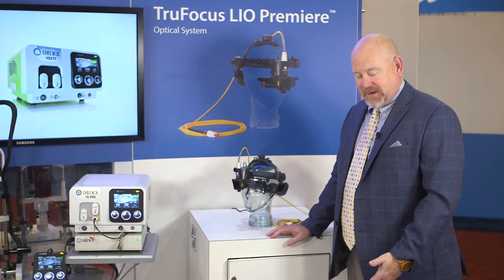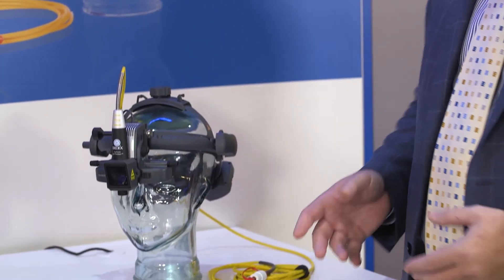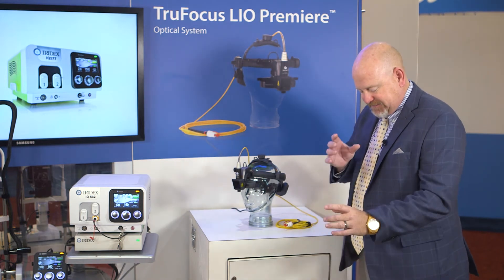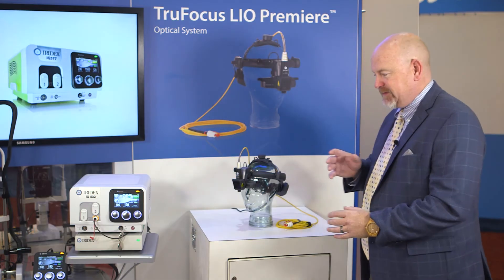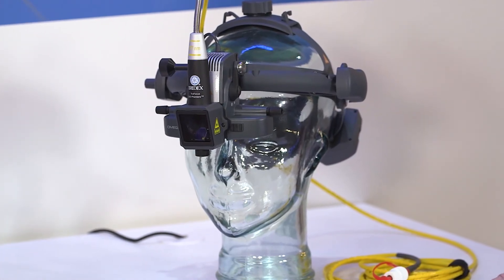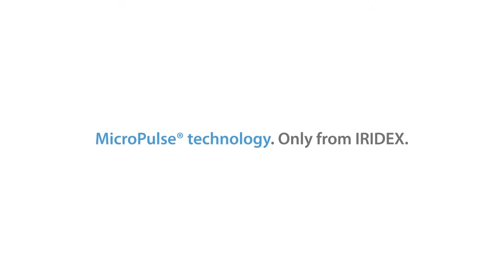Another advantage of the wireless footswitch is the ability for the physician to not be tethered to the laser when using the LIO. With the LIO on the head and the patient in a supine position, as he's focused on the patient, he can also adjust the power without leaving the patient, going back to the laser, and coming back to the patient. He can be all set up in his lane or in his clinic and administer the procedure quickly and efficiently.